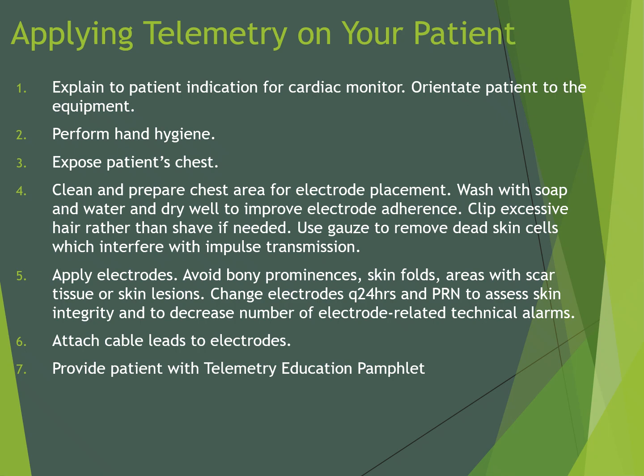transmission. Step 5, apply electrodes, avoiding bony prominences, skin folds, areas with scar tissue or skin lesions. Change electrodes every 24 hours and as needed to assess skin integrity and to decrease the number of electrode-related technical alarms. Step 6, attach cable leads to electrodes. Step 7, provide the patient with the telemetry education pamphlet.